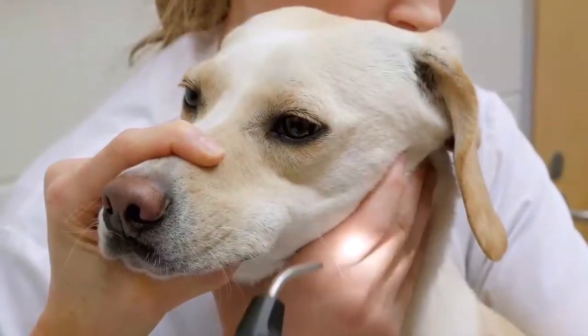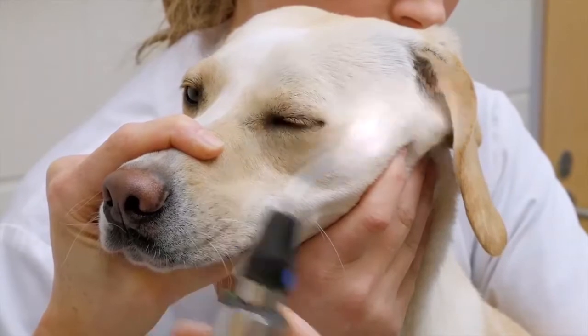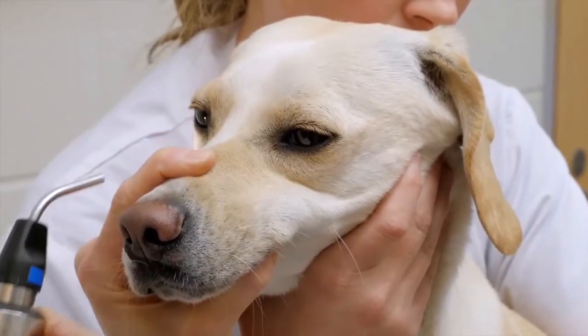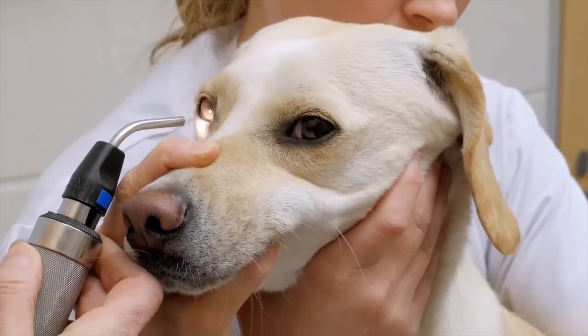Dazzle reflex. This reflex is initiated by shining a bright focal light source, such as the transilluminator, on full brightness into the eye. This should result in a partial blink or squinting response of the eye.